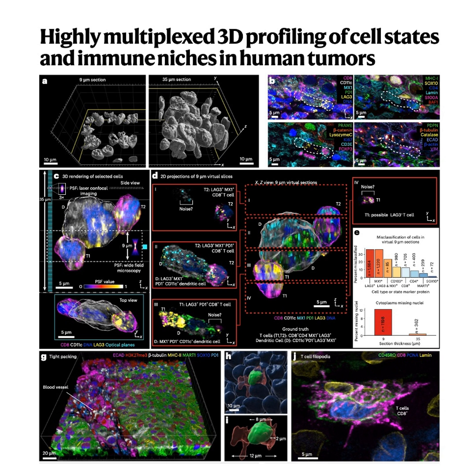Okay, and this is where the paper drops the bombshell, right? Because it gets really interesting here. The study found that even when they accounted for something practical, like rehydration, the tissue swells a bit when you put it back in liquid, so that 5-micrometer slice becomes maybe 9 micrometers thick. Even then, they discovered that nearly all the cells and, crucially, their nuclei were incomplete, sliced right through. Yeah, it's not just a minor technical issue. It's, like you said, a fundamental failure of the method we've relied on.